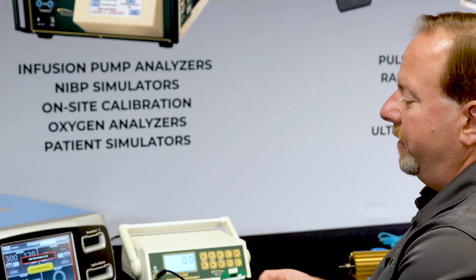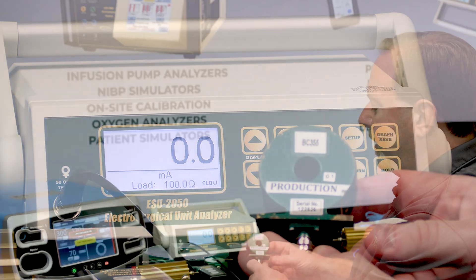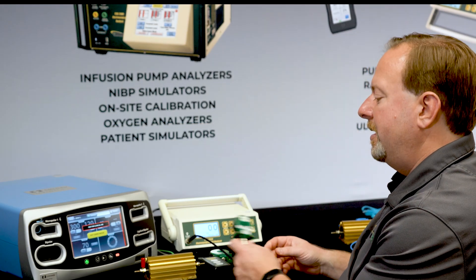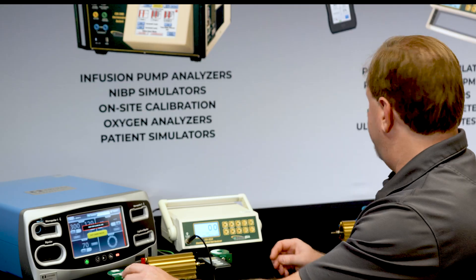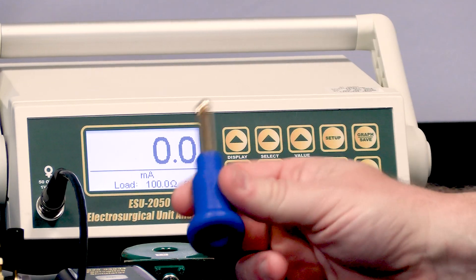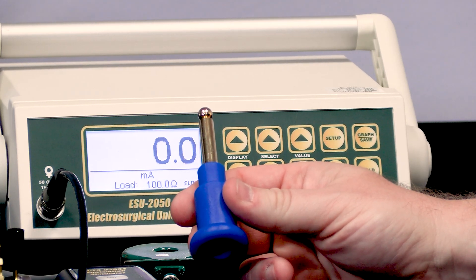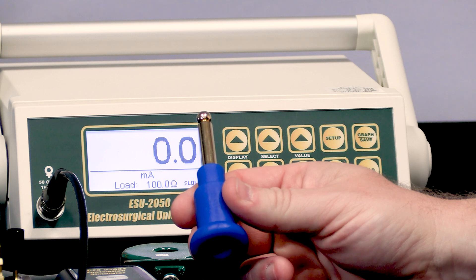To make our connections for leakage testing, we have our 0.1 to 1 current transformer that's connected to the 2050 already. We also have our footswitch port adapter since we're going to start with monopolar output testing.